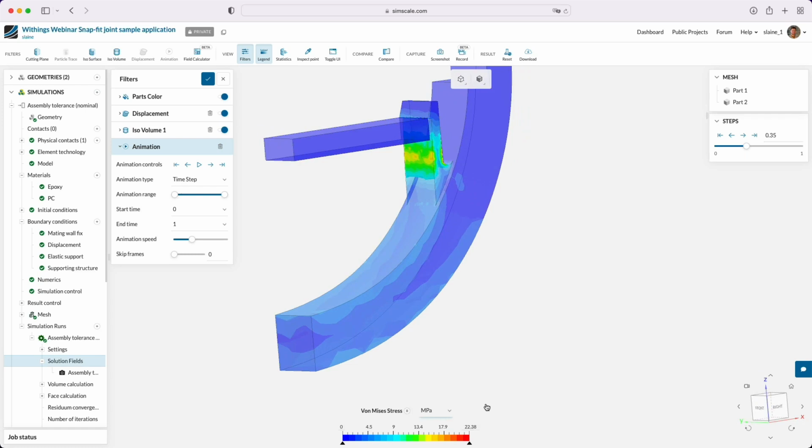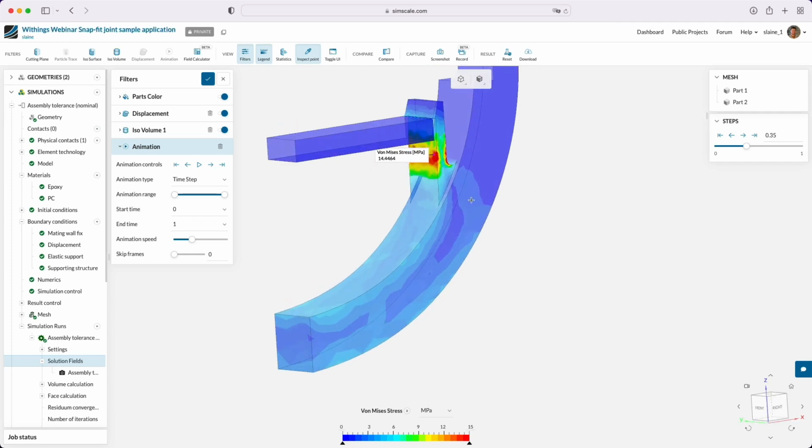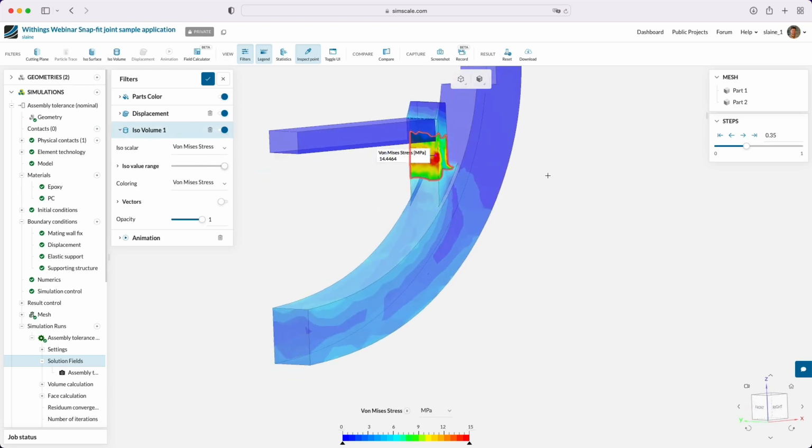So we've got some peak stresses down in the tang, and we could pick out what some of these are. So, we've got stresses of up to about 13, 14 megapascals, and we can obviously highlight regions of stress with the isovolume as well.